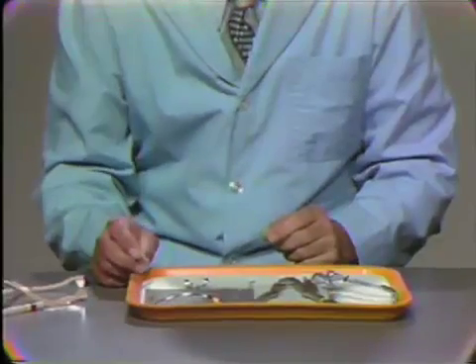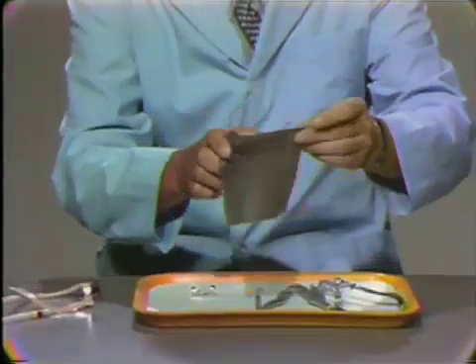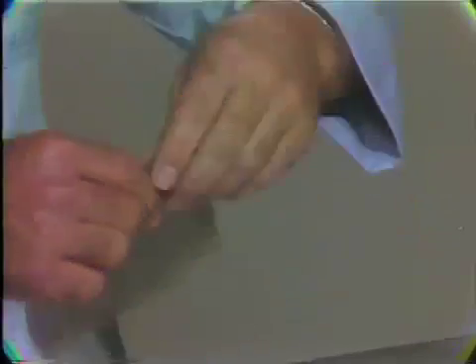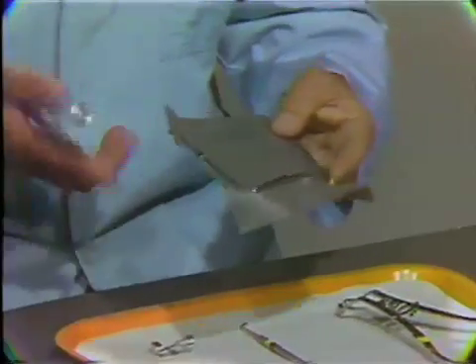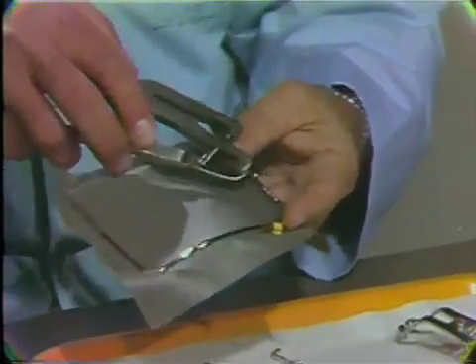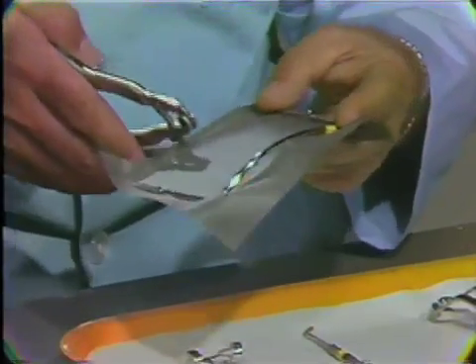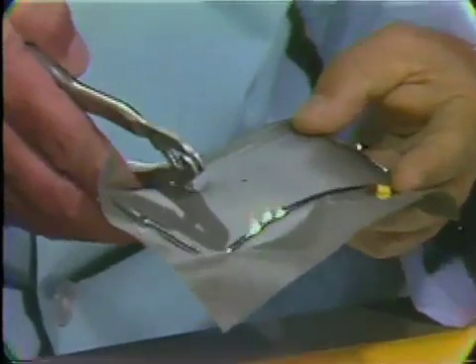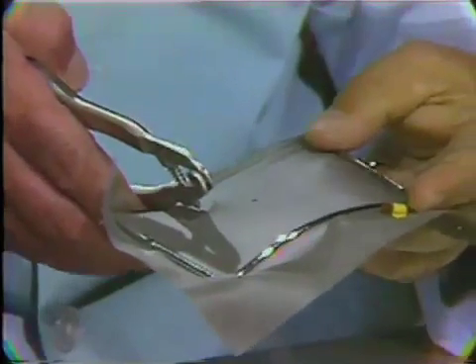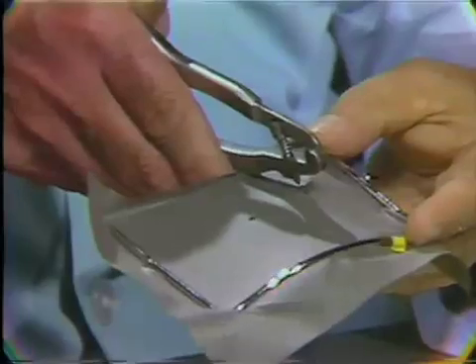There are several different ways to put on a rubber dam. The most efficient and easiest method is to place the frame on the rubber dam immediately, providing a smooth stretched surface. Then, depending upon the tooth to be isolated, a hole is punched in the rubber dam. For almost any maxillary tooth, the hole can be punched somewhere in the horizontal midline of the rubber dam. A maxillary central, lateral, or cuspid could be punched somewhere in the middle of the dam. If working on a maxillary molar or any posterior tooth on the right side, punch the hole a little above the midline and a little to the right of center. If it were a left maxillary posterior tooth, punch the hole a little to the left of center and a little toward the superior border of the rubber dam.